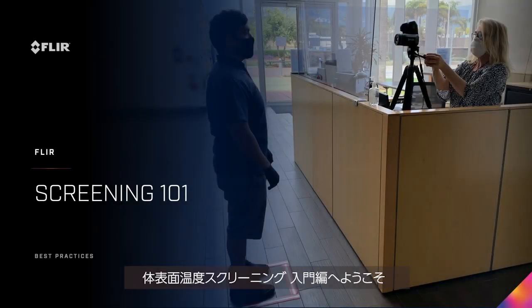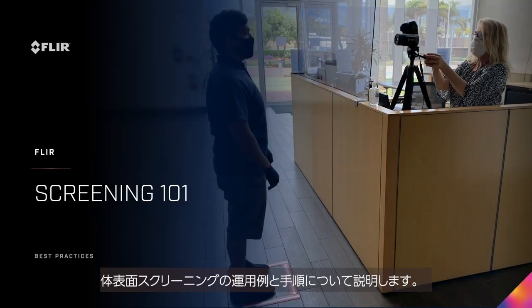Welcome to EST Screening 101. In this tutorial, we will cover best practices and procedures for day-to-day screening.